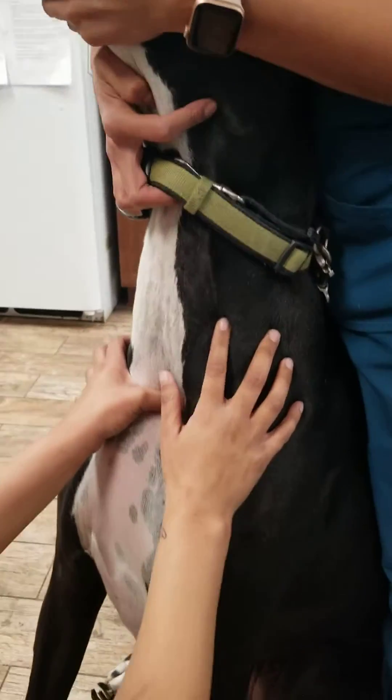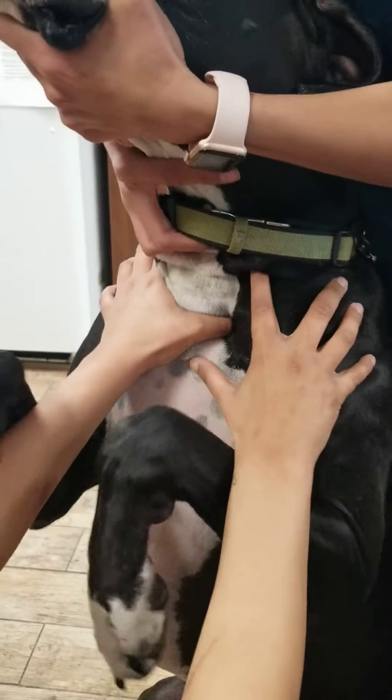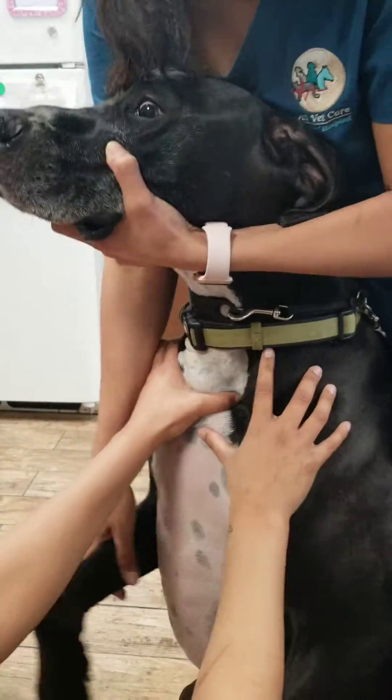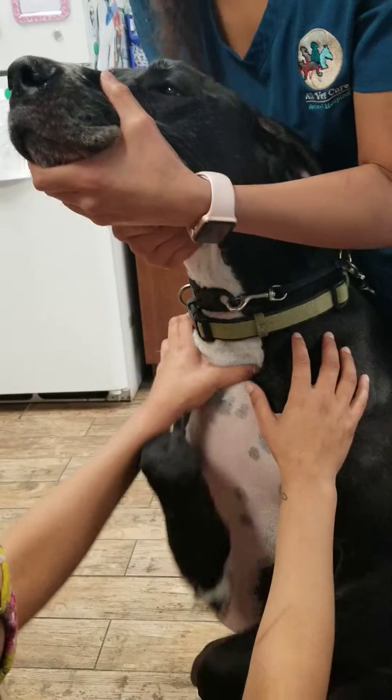So right now I'm just feeling for the vein, which is right here. I can feel it. Honey, it's okay. Does somebody want to hold the legs?